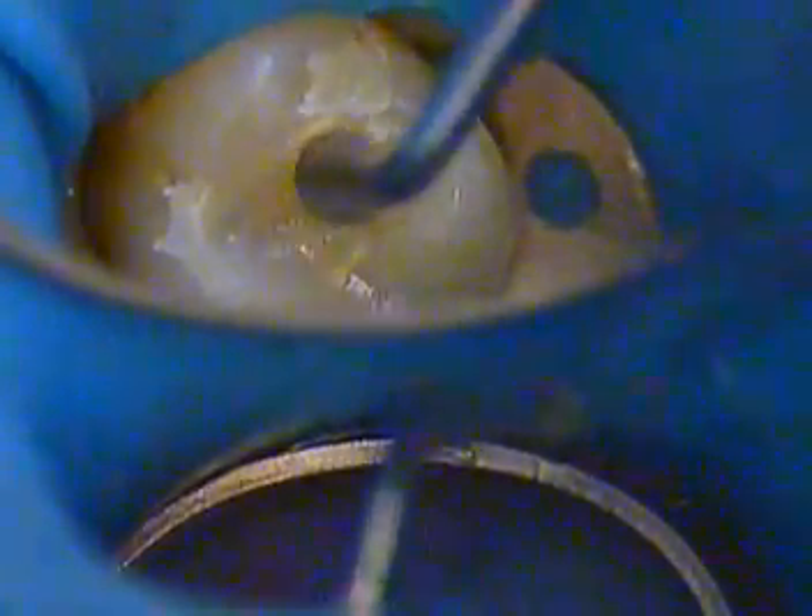Now I'm going to use one of an old amalgam instrument — we call it a swedger or an acorn instrument — and we're going to push that around, then carve it. Right now it's in the soft phase, so you've got time to carve it and put in your anatomy. It's very condensable and it doesn't stick to an instrument. Notice — no layering involved. You just literally go in there and carve right away.